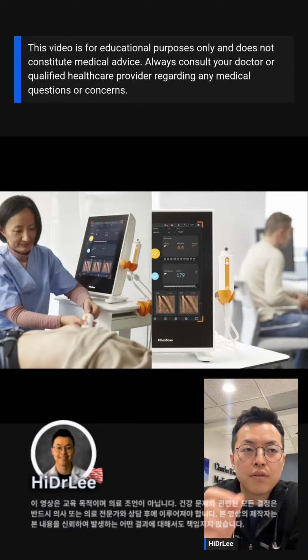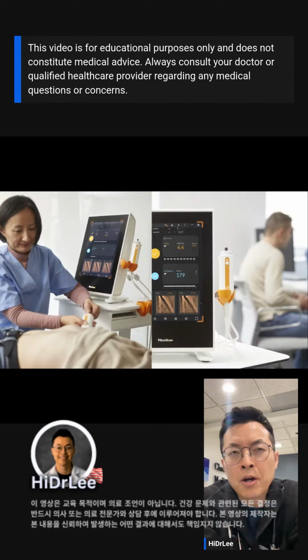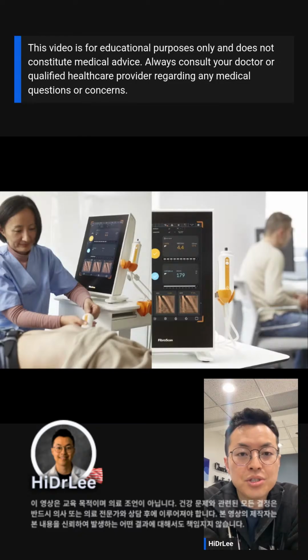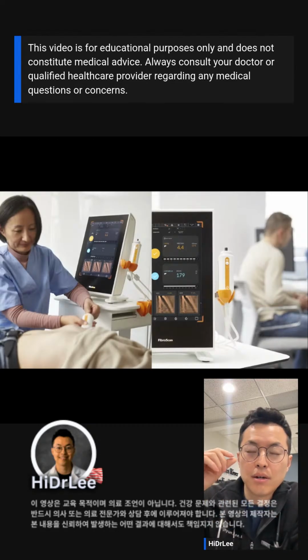The fat in the liver is called fatty liver disease. And oftentimes, this may lead to a more advanced form of liver damage and cause scar tissue in the liver, which is liver fibrosis, and that's why we call this machine Fibroscan. Fibroscan tells us whether you have fat in the liver, but something beyond that.